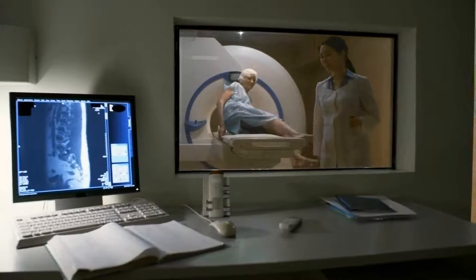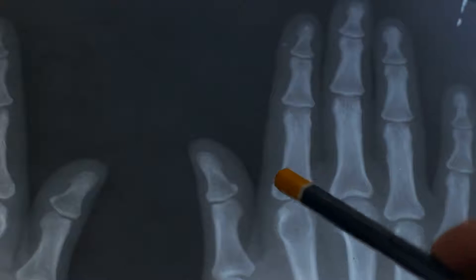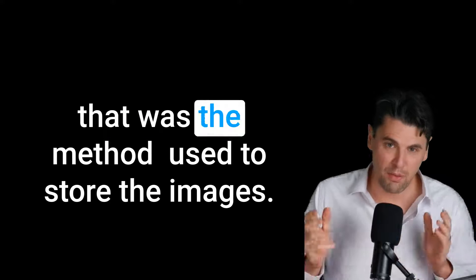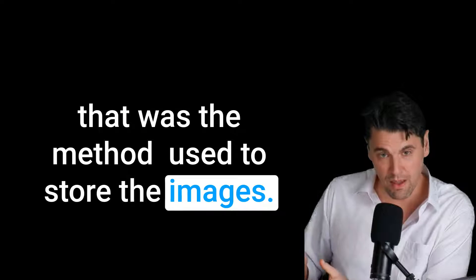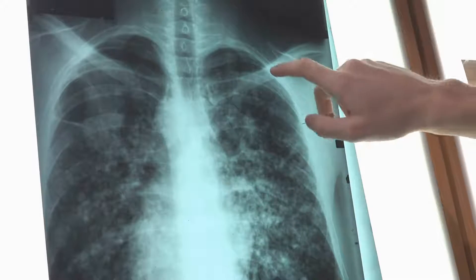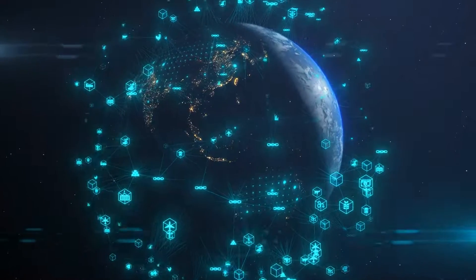Coming up here at our radiology. So when I was born, most of medical imaging was taking x-rays and storing those x-rays in large file folders. And that was the method used to store the images. You have a physical media there that you could look at on a light box. Today, it's all digital.